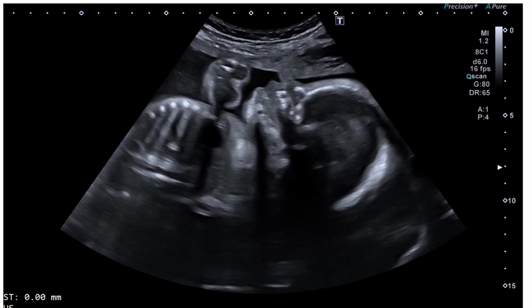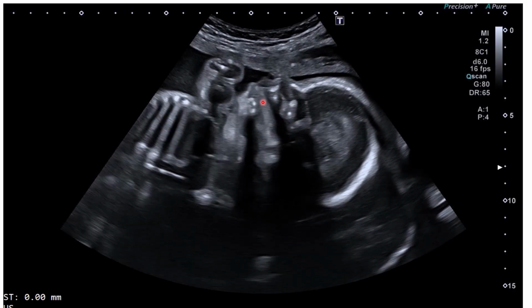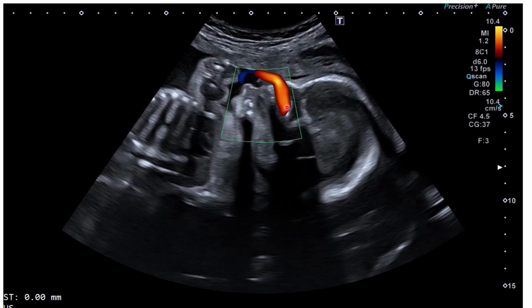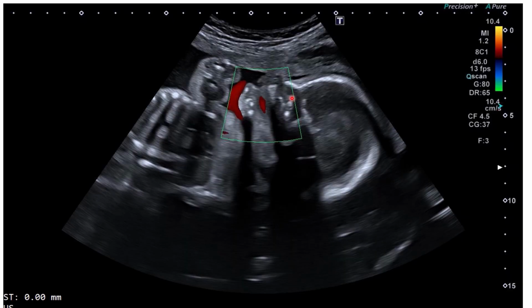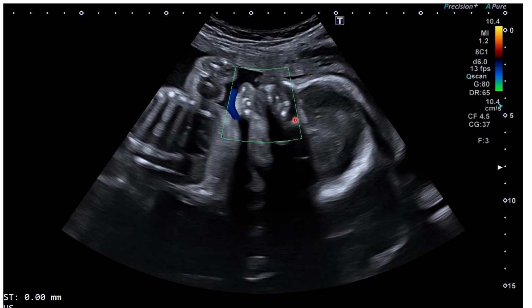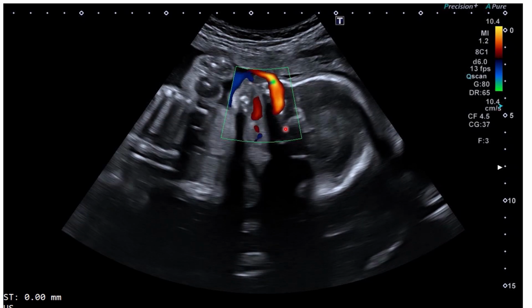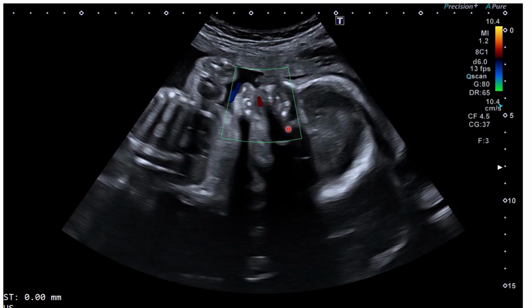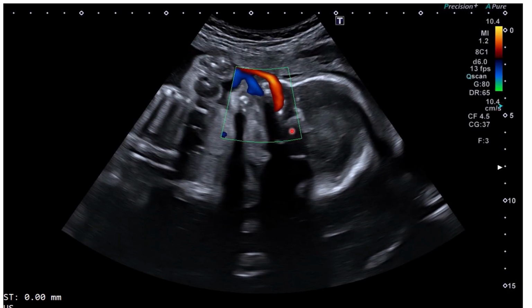So you can see here in the proper view, you can see the baby swallowing there. This is breathing, you can see that's the nose there. So this is how you see the breathing. The nose, you can see the color flow there in the nose. That's how the fetus is breathing.